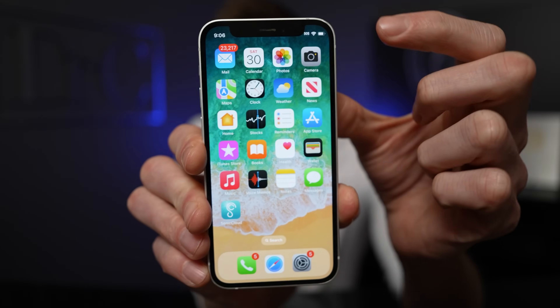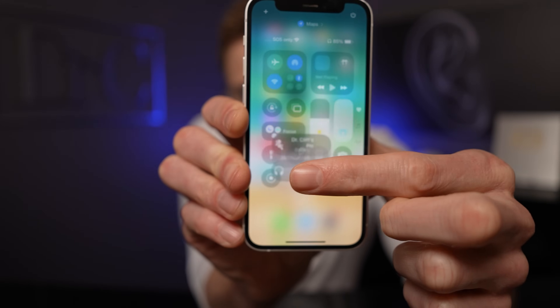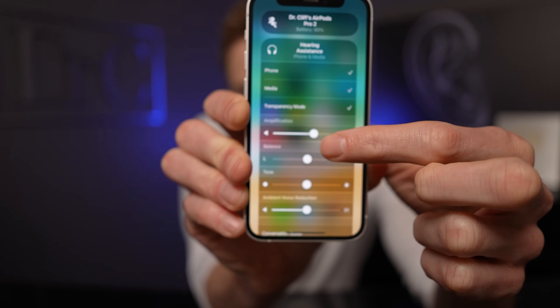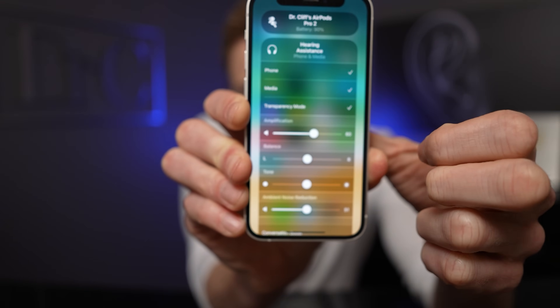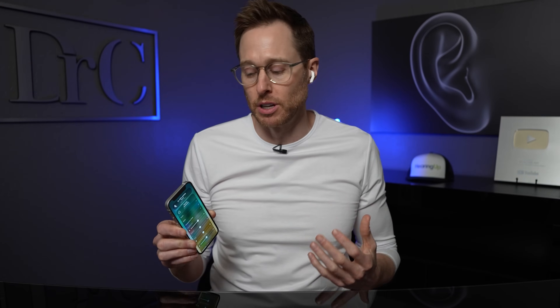Once you get the hearing aid adjustments set up the way you initially want them, you do not have to go all the way back through the phone settings to readjust them. Swipe down from the top right-hand corner to bring up the control center menu, and tap on the little ear icon to open up the hearing assistance option. You'll have all of the same adjustments available but you can get to them much quicker. You can also see the AirPods battery life on this screen — the hearing aid feature does chew down battery life much quicker, so checking it periodically throughout the day is easy this way.